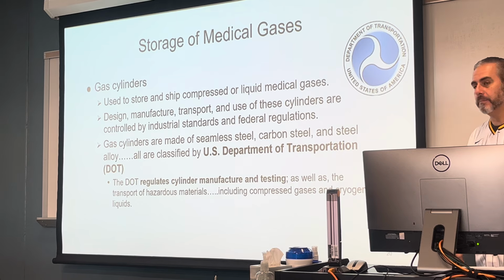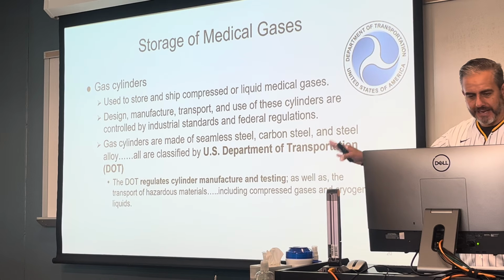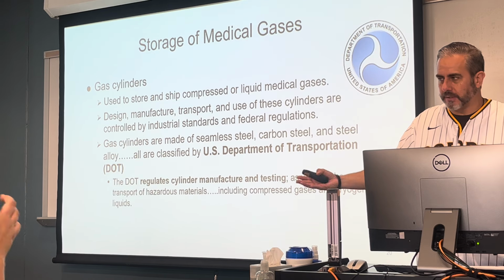They regulate the manufacturing and testing of these cylinders, as well as transport of hazardous materials, including these particular things. I think that makes sense. It's part of transportation. They should regulate.